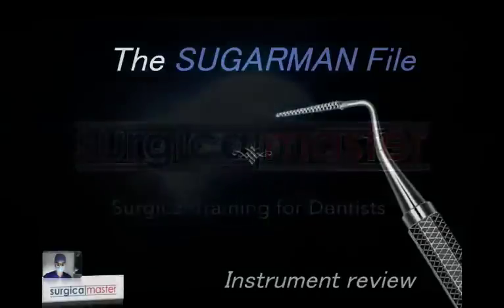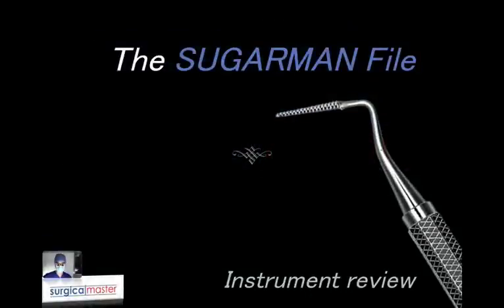Hi everybody, Ziv Simon here. I'm the creator of Surgical Master, the surgical training for dentists. Welcome to this video. In this one, I'm going to review a very important instrument that you must have in your surgical kit when you're performing periodontal surgery, specifically crown lengthening and also osteosurgery.